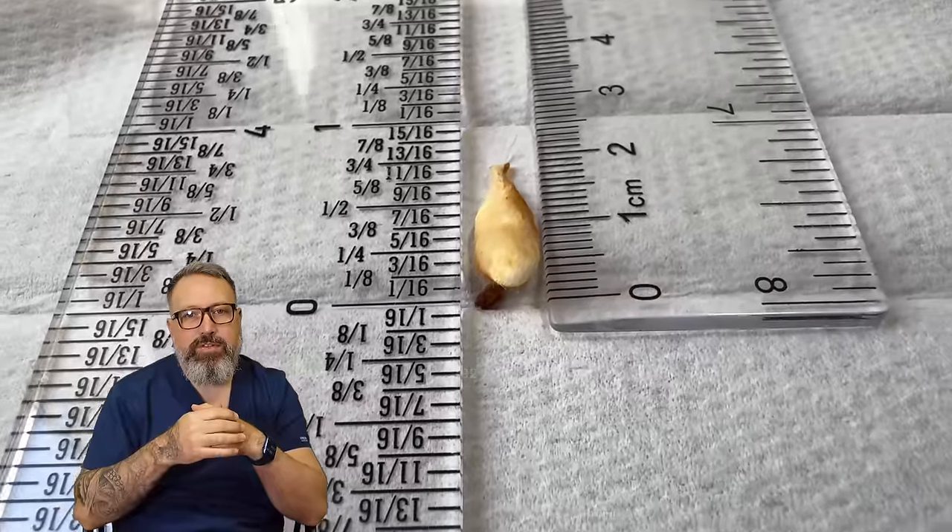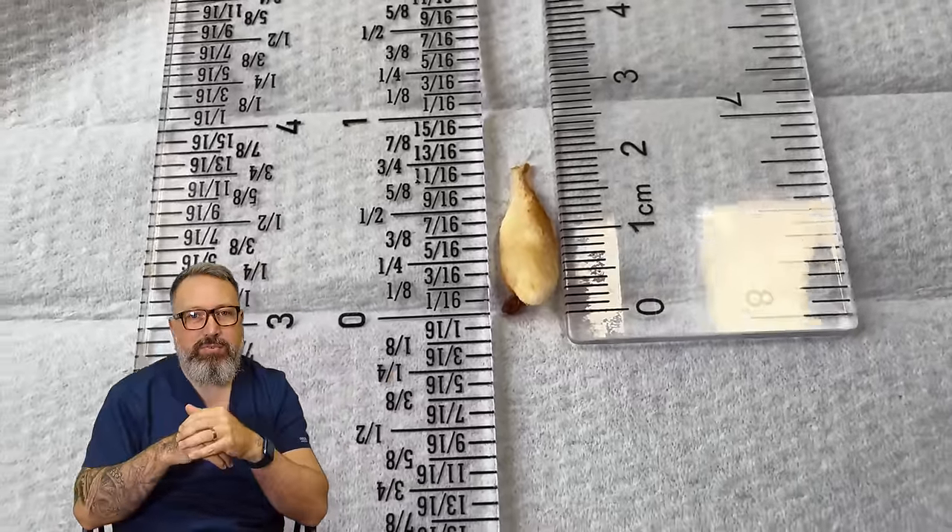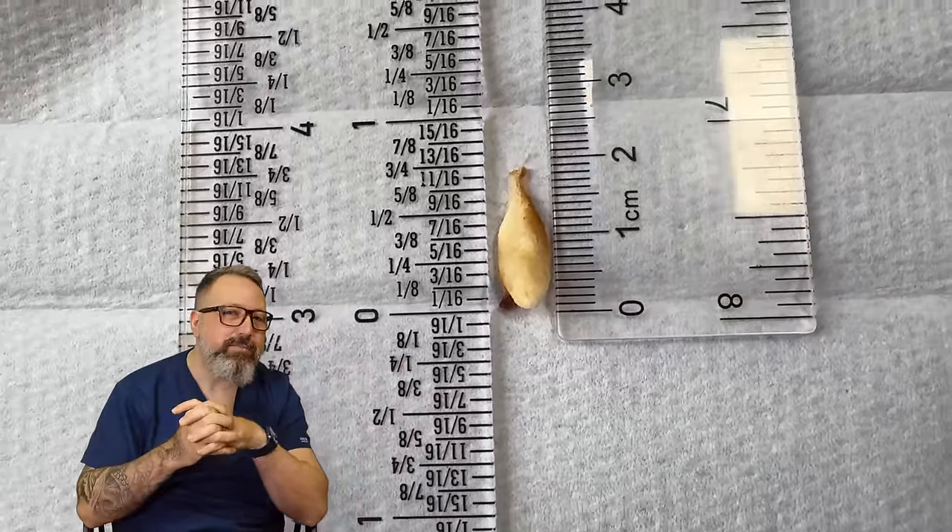Sometimes the blood supply isn't quite as good to the ear canal walls, and that can also slow epithelial migration. So you will get this keratinous skin forming much deeper in the canal than you normally would. So we've got debris - the cotton bud and a tiny little bit of wax that we just took away. There's three quarters of an inch, two centimeters on that one.